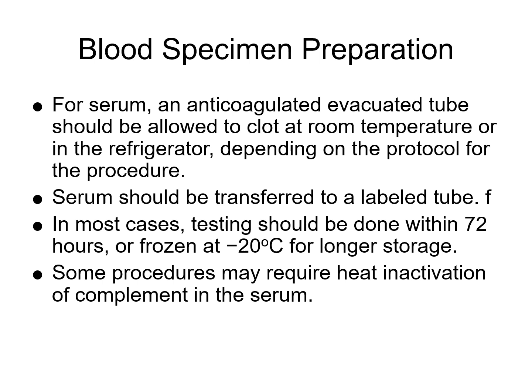There are some special procedures in the serology lab. The first one is the heat inactivation. Some serology tests may require heat inactivation of complement in the serum. This typically involves heating at a specified temperature for a set amount of time. Again, you're going to follow your specific protocol and instructions carefully to ensure that you do it appropriately.